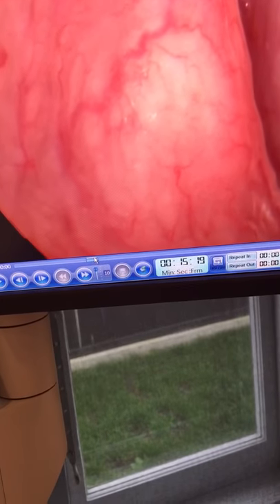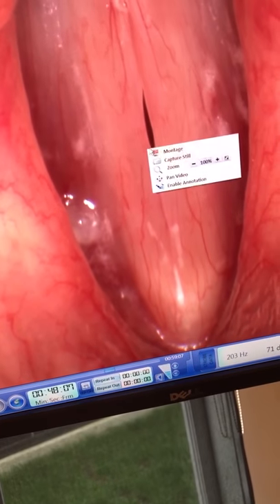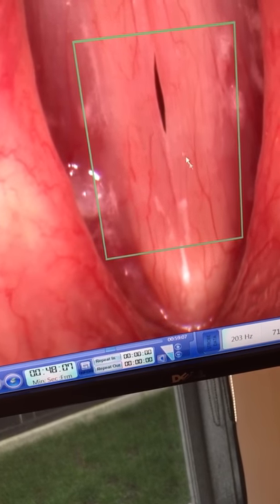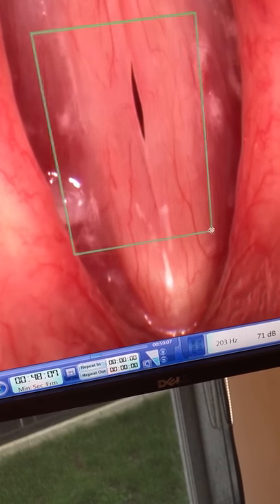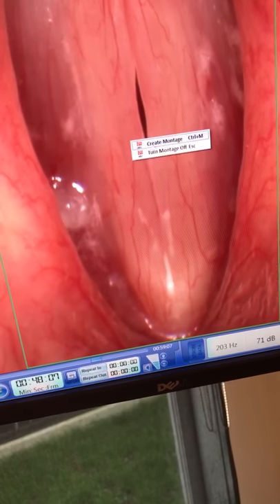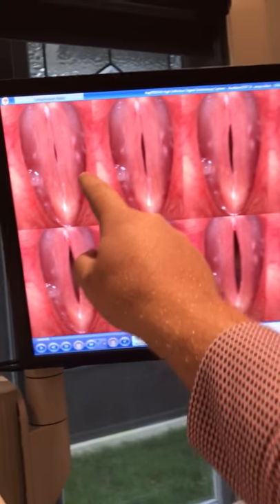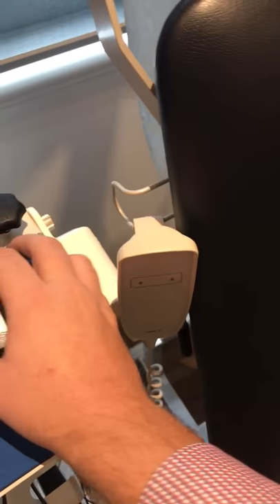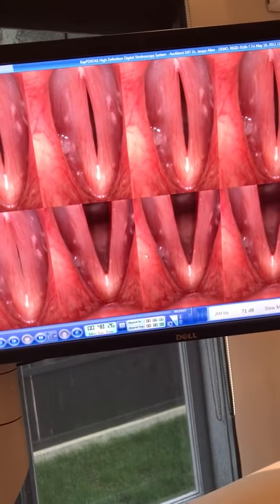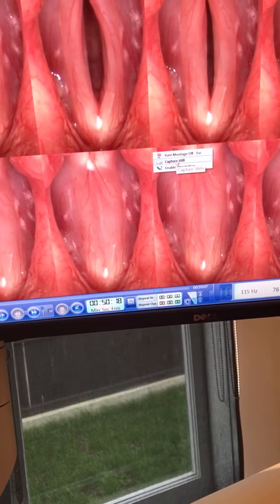Down here I can bring this forward if I wanted to. I can right click on here, I can capture the still, I can zoom it in — it's a digital zoom. Or I can do a montage. Montage is pretty cool. So right click again, create montage — and what we have here is a sequential montage. I'm going to use the middle mouse button to scroll through, and you'll see it's all scrolling. That's pretty cool. Now I can also right click and capture a still from this too.